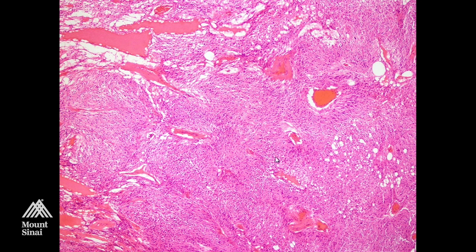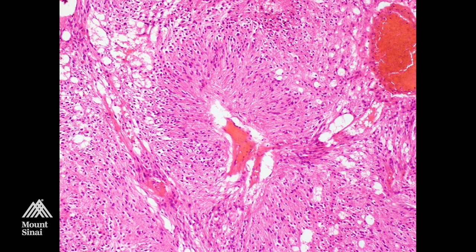When you look under the microscope, you can see these variably sized vessels with blood, and then all these densely packed solid masses of proliferating tumor cells in between the blood vessels. Just a higher magnification view, and you can see how there tends to be a perivascular orientation in these spindled glia around the blood vessels. It's somewhat similar to what you can see in ependymoma, and I'll discuss in a second the suggestion some have made that these might be ependymoma in the eye.